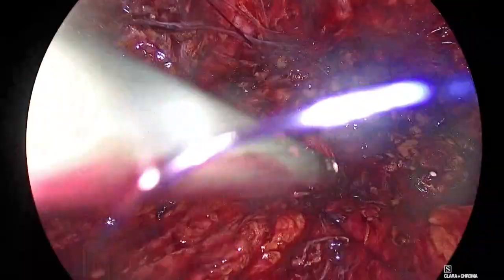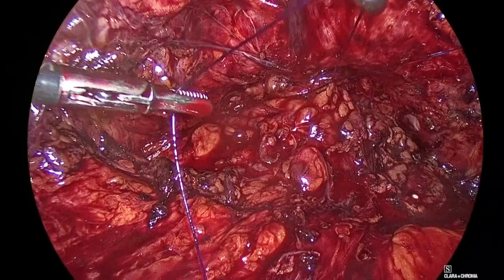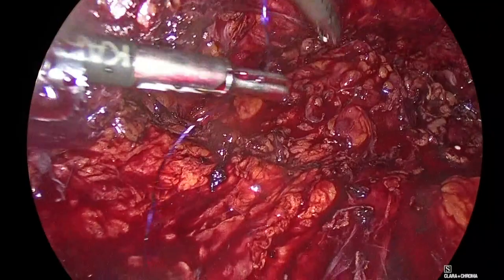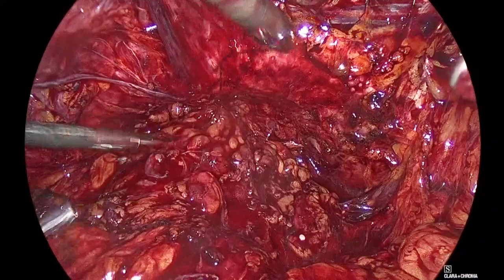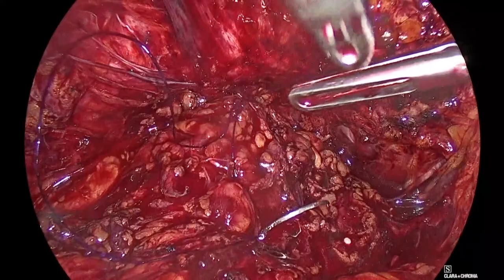Panagiotis, go on the right side. Good. One. Two. Show me on the right. Padeli, on the right. All inside? All inside, huh? Good. So now we have one knot that will shrink the anterior bladder neck on the anastomosis.